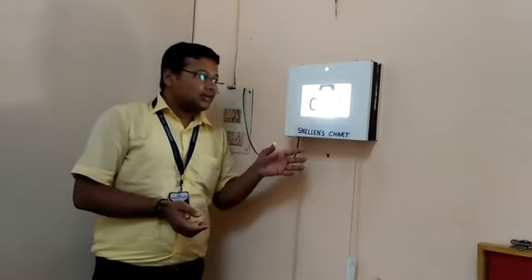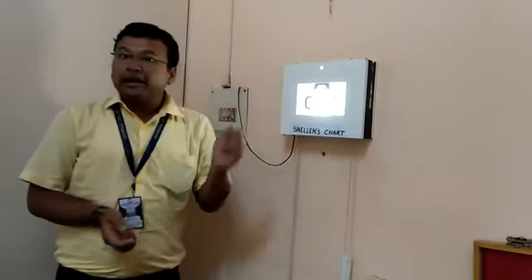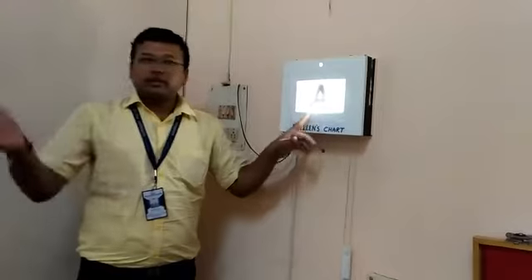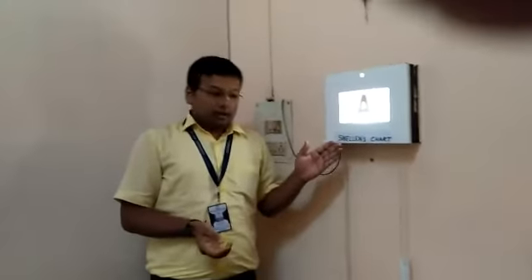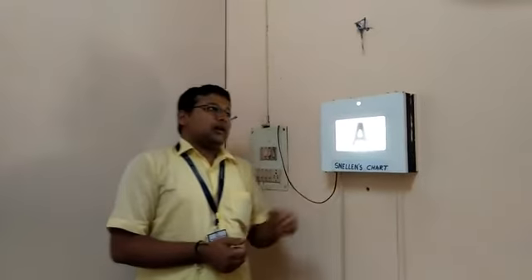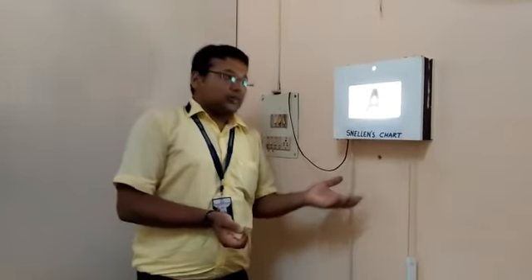Or if the patient can read only one letter from the 6/36 line, then his or her visual acuity is recorded as either 6/60 plus 1 or 6/36 minus 1. But if the patient can't read the top letter from 6 meter distance, then you have to reduce the distance between the patient and the chart by 1 meter at a time. Say if the testing distance is 5 meter, then his or her visual acuity is recorded as 5/60. If it is 4 meter, then 4/60, 3/60, 2/60 or 1/60.